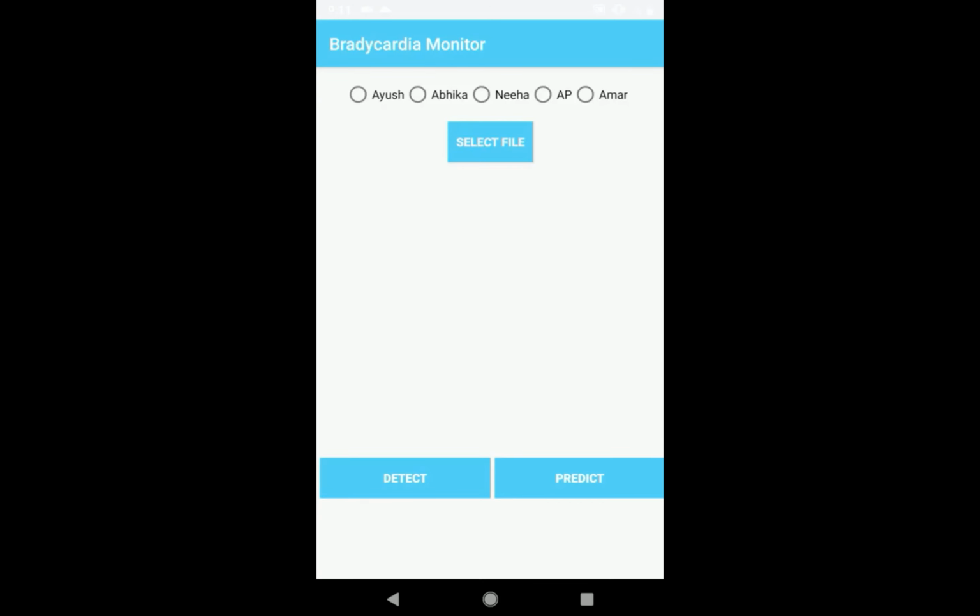As for the first step, data collection, the 5 team members contributed, 10 hours each person for 5 days. This data was collected using the wearable sensors which we got from the Impact Lab. After this collection, we have to pre-process the data.